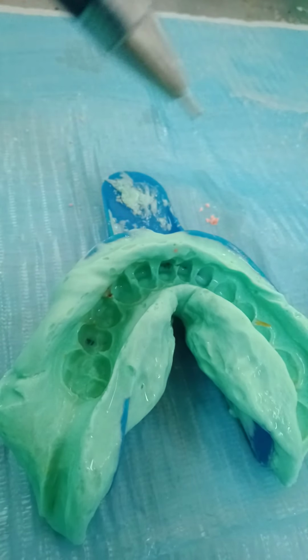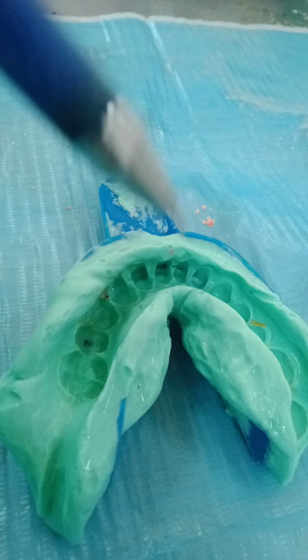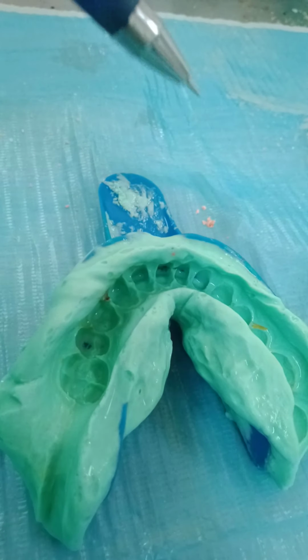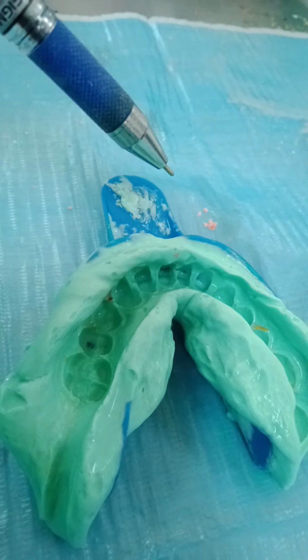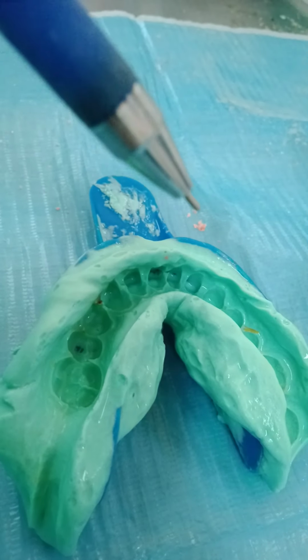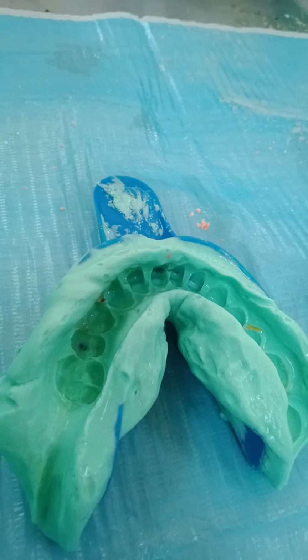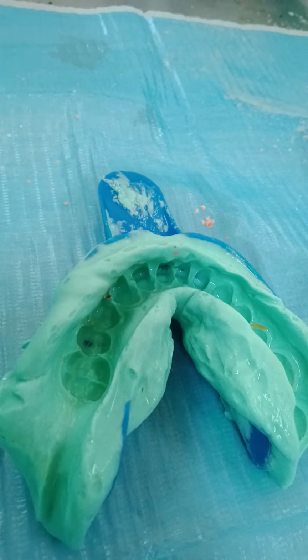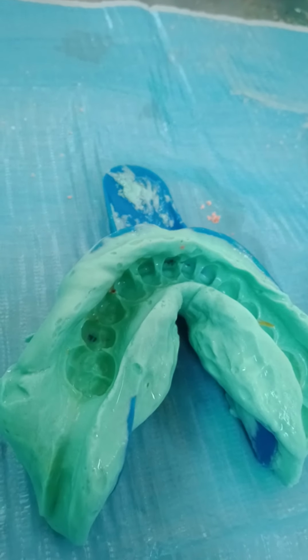You might go inside the patient's mouth with the tray, but before pressing vertically, I stretch the lip and then press on the teeth with the impression material. This allows the excess material to go into the sulcus rather than trapping under the lip and dragging, because the lip will drag the material away. So you'll not have enough material to go inside the sulcus.